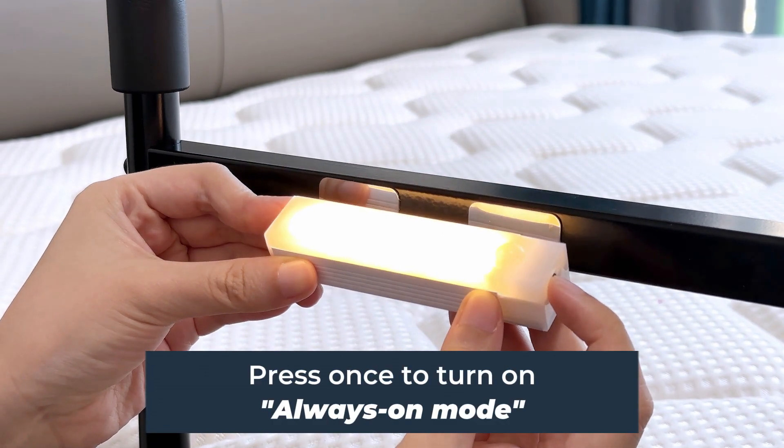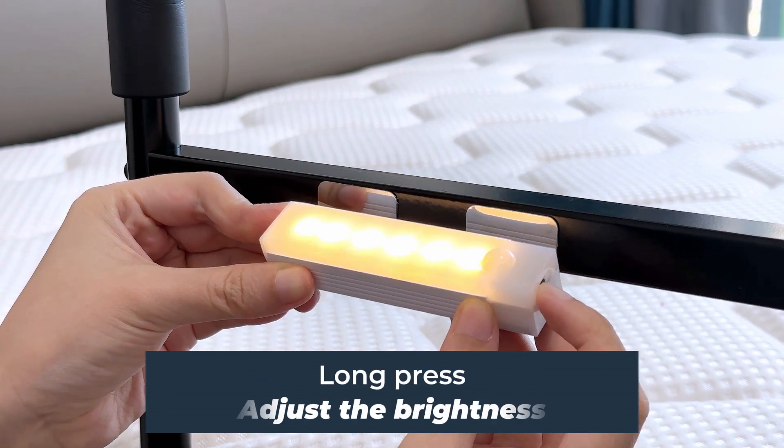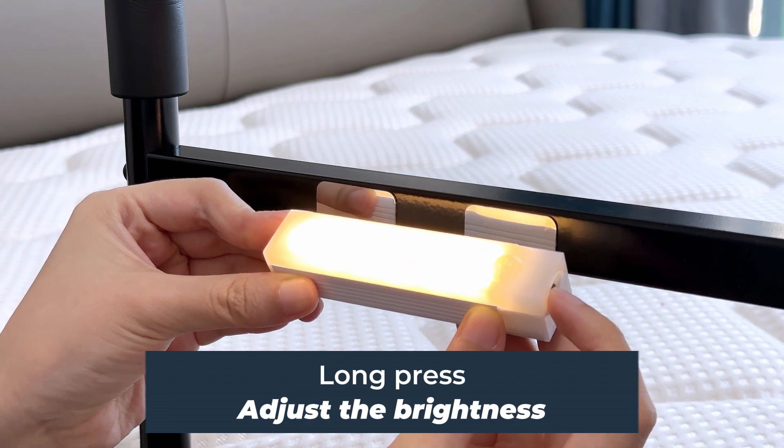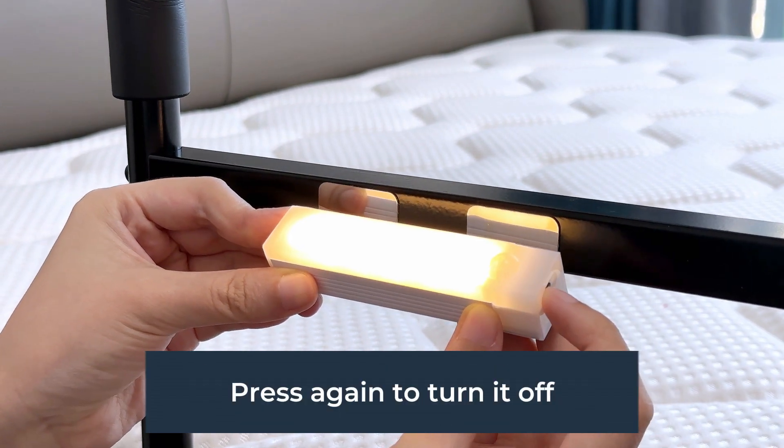Step 6 - switch modes: press once to turn on always-on mode. Long press to adjust the brightness. Press again and it flashes three times to enter all-day sensing mode. Press again to turn it off.